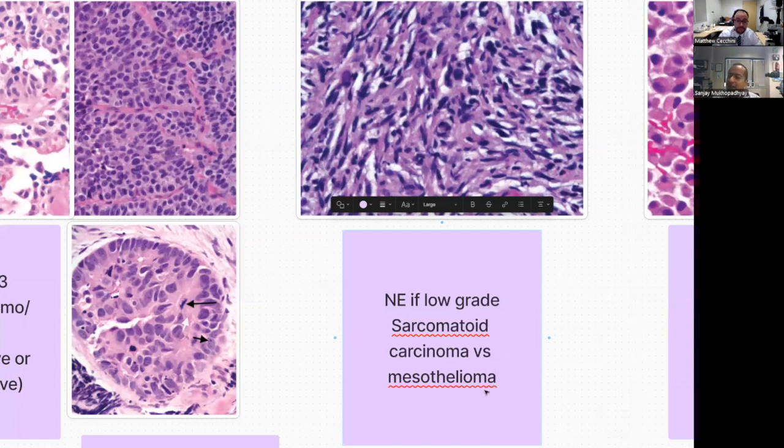And in that differential, I think by far the most important thing is where is the mass. If the mass is a parenchymal lung mass, I don't think any immunostain overrides that. This is my personal opinion. I don't think any degree of GATA3 staining or WT1, anything, overrides an intraparenchymal lung mass. On the other hand, if it is pleural, if this kind of a mass has multiple pleural lung nodules and an appropriate clinical setting, an elderly man, unilateral, I think no immunostain, other than TTF1 maybe, no other immunostain will change my mind that this is likely to be a sarcomatoid mesothelioma in that setting.